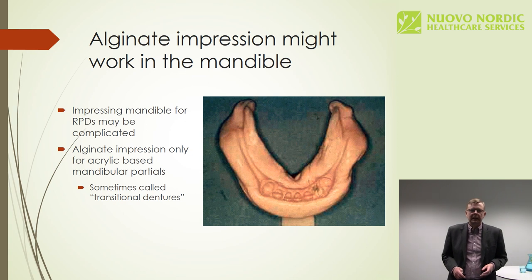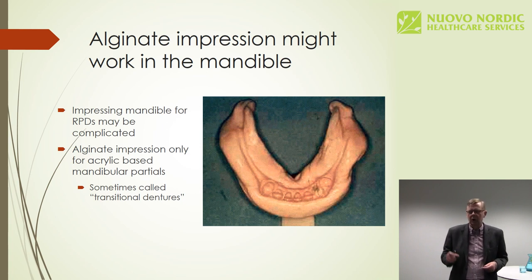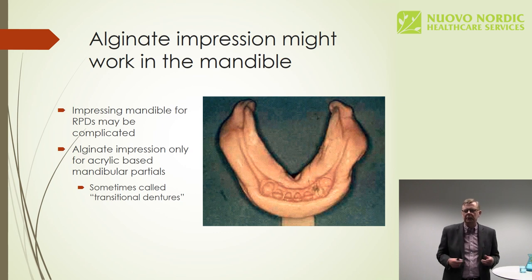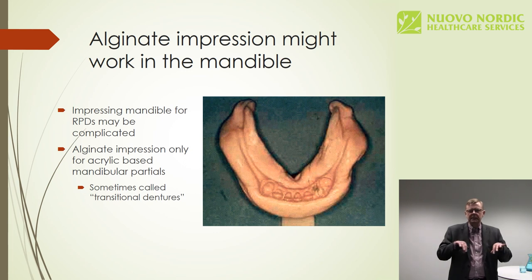So, the impression of the mandible is a bit more complicated in this case, especially if there are long teeth in the anterior region. You may have to tilt the tray downwards in the posterior region, because otherwise you're not able to impress the lingual extension, the mylohyoid area, etc.